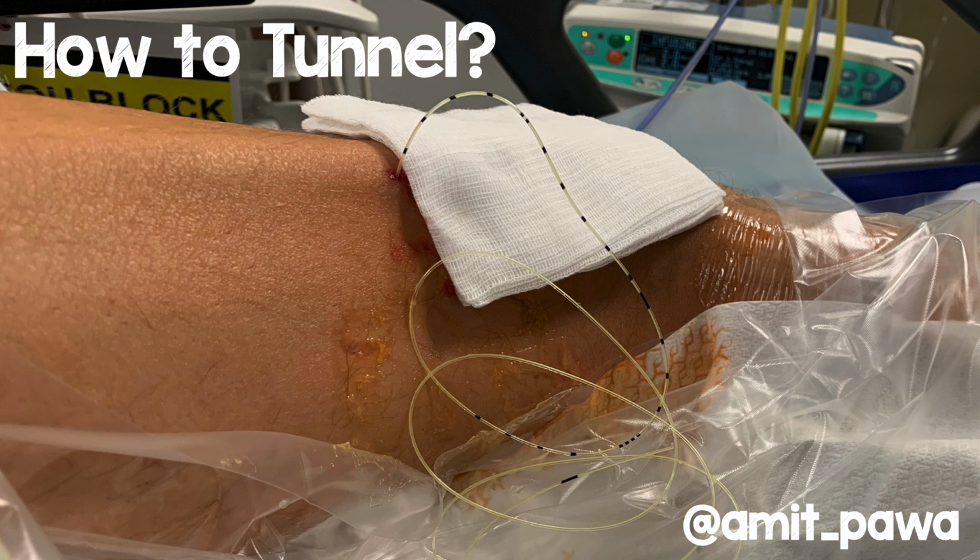There are a number of different ways for how you might tunnel. This is one particular technique. And I know other people would tunnel leaving their needle still in situ to protect the catheter. But this is one example where you can use the block needle that you use to put the catheter in to help you with tunneling.